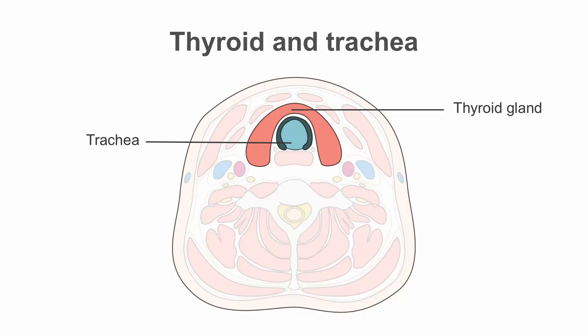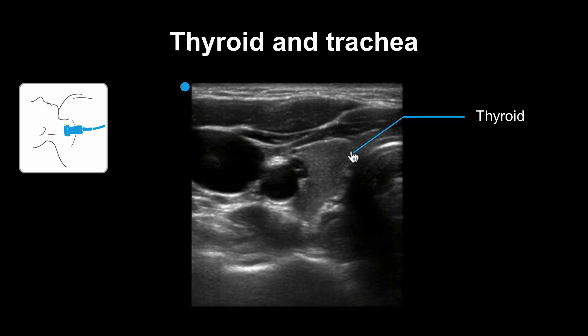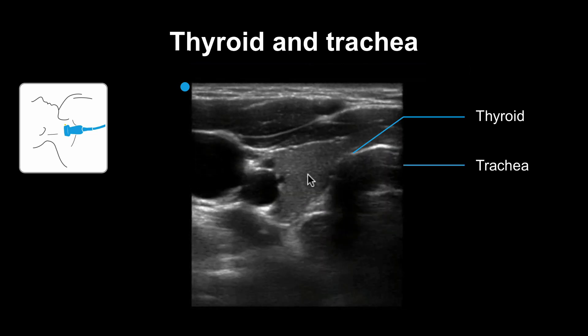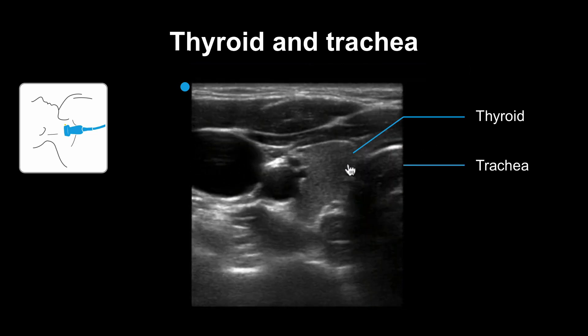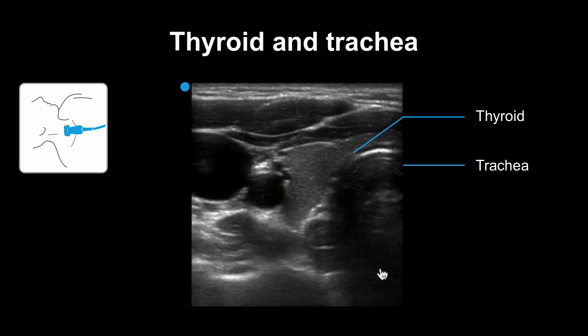This cross-sectional image of the anterior neck shows the relationship of the thyroid and trachea to the internal jugular vein and the common carotid. The solid structure here is the thyroid. The trachea is just behind with cartilage rings and air within it that causes shadowing downward.